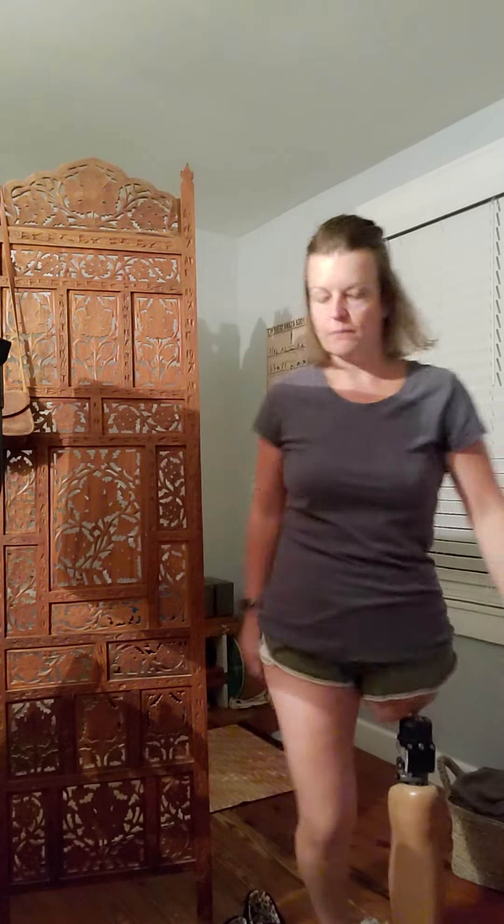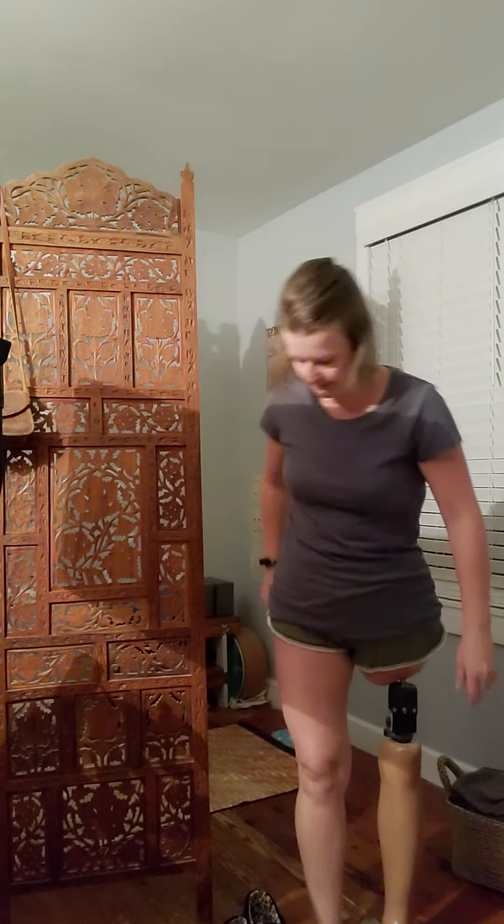I'm Linda. I'm about eight months post stage two Opra implant. I walk unassisted, and today, just to give you an example, I woke up at 5 a.m. and put my leg on at 5:30 a.m.